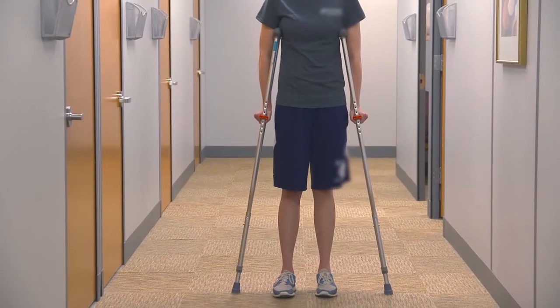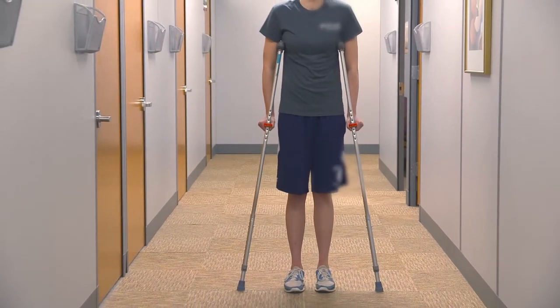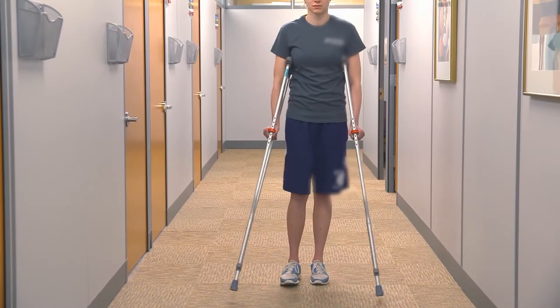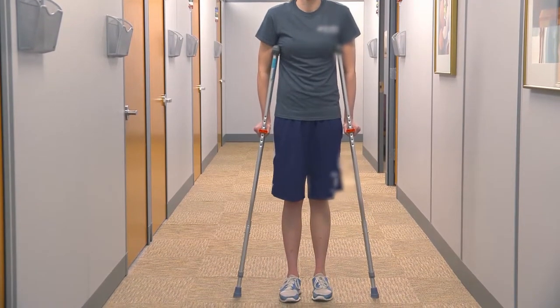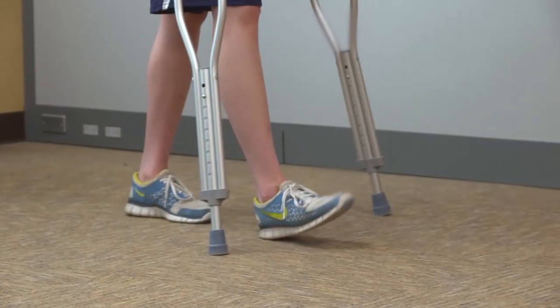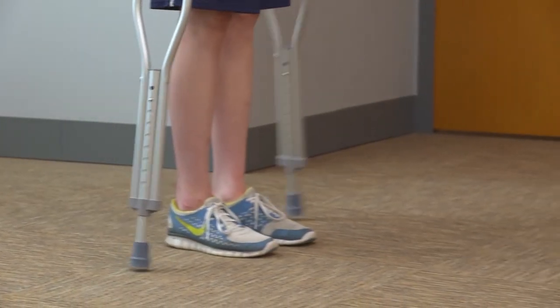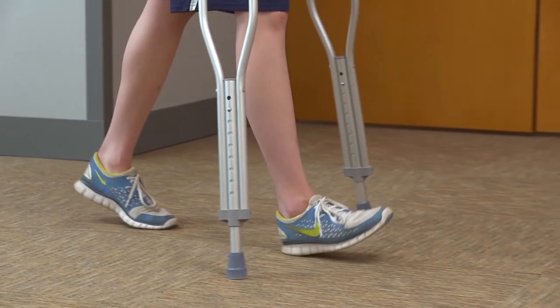The sequence is: crutches, surgical leg, non-surgical leg. As you advance the surgical leg, make sure the heel of your foot touches the ground first and then the rest of the foot. This will help to maintain the normal heel-to-toe gait pattern and help with walking in the future.